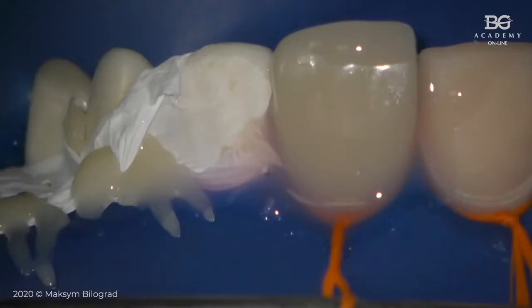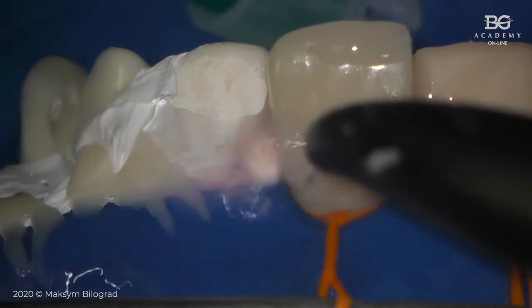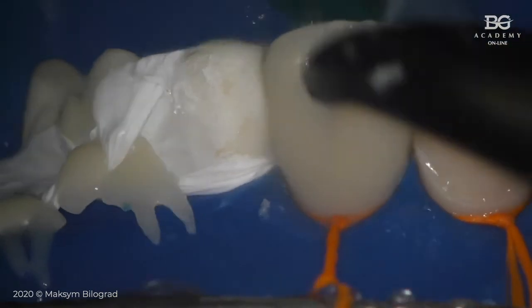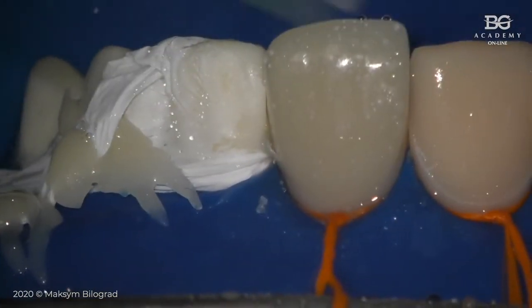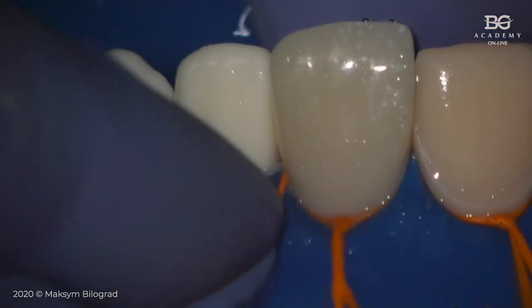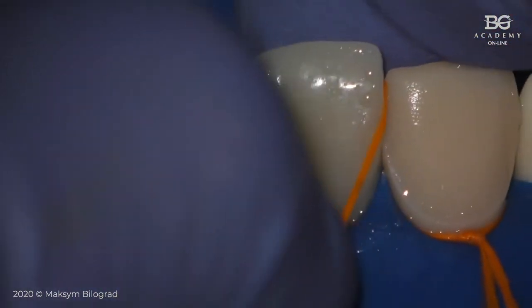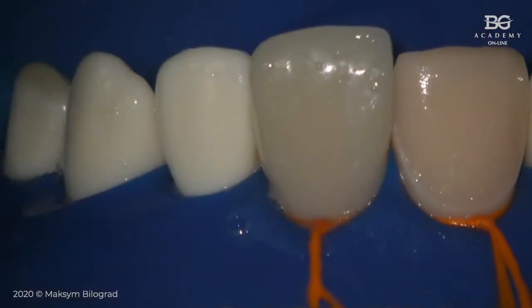So done. Good. Now we will just rinse out this glycerin. We can take out Teflon. We can take a floss just to check proximal areas, to clean some cement between. In this case, there was a little bit, so we take floss.